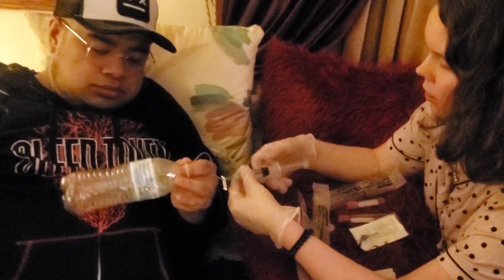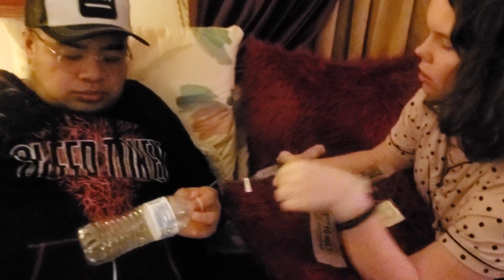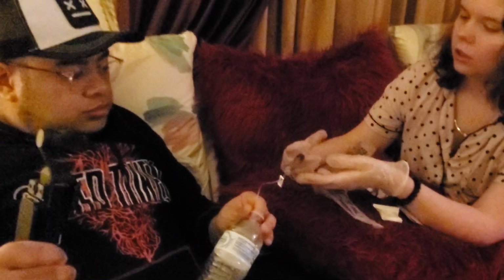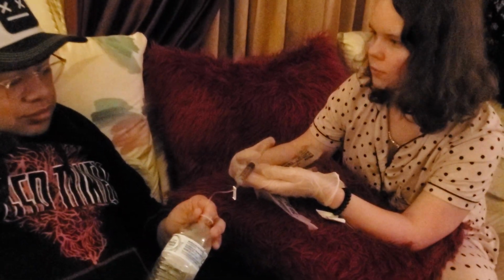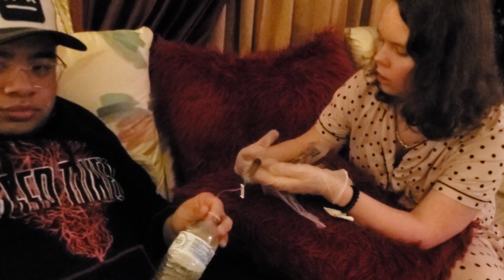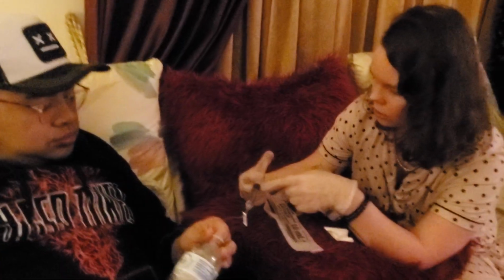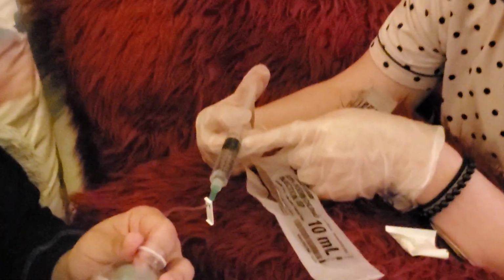For CVADs, we are going to always flush 10 mLs of saline because the line is very long. Pretend it's long. And for the first flush, I can do that for about 2 to 3 minutes. Before I do the whole 10 though, I'm going to push 1 to 2 mLs just to check for patency.